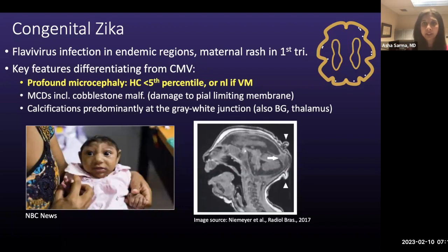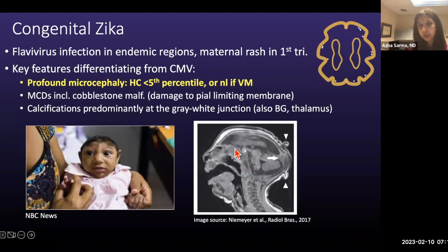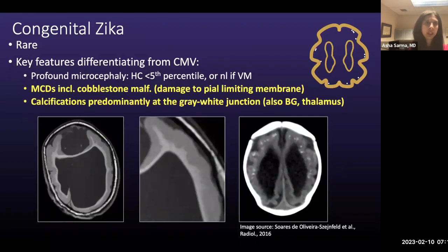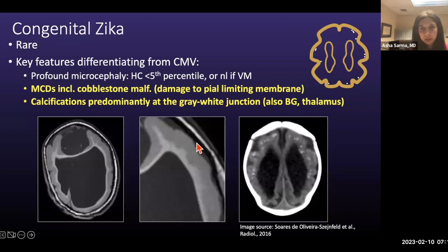Calcifications in Zika are predominantly at the gray-white junction — not periventricular — and can also be seen in the basal ganglia and thalamus. Here's a patient showing profound microcephaly with a markedly decreased craniofacial ratio, shelving of the occiput due to sutural overlap, and redundant skin folds. The cobblestone malformation has a fine, lumpy, bumpy, thick, almost lissencephalic appearance of the cortex — lissencephaly is actually a misnomer, but it simulates lissencephaly. You can see these calcifications at the gray-white junction.